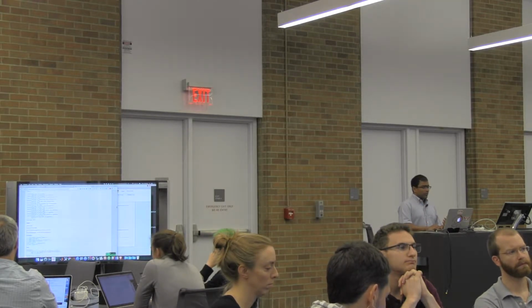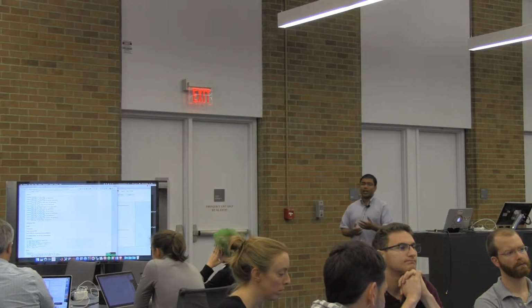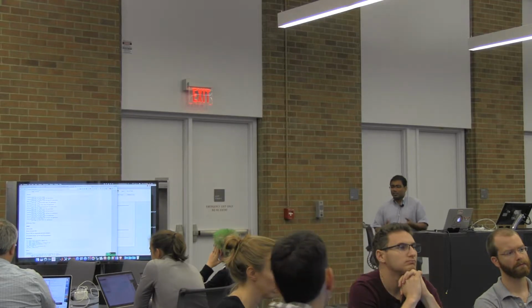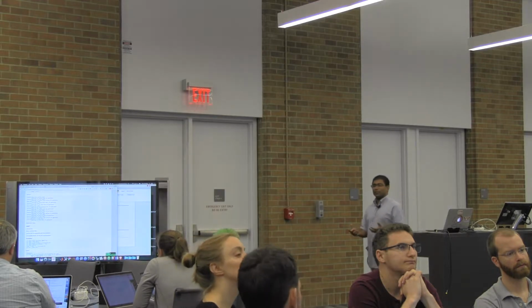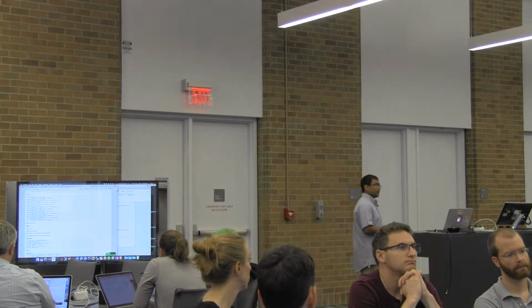So now we can go down and look at outputs. And every output has a name. That's something that's really not available for most things. When you run a command, it creates a bunch of files on the file system. It doesn't categorize those files in any meaningful way. You have to interpret what those things are and deal with them, right?